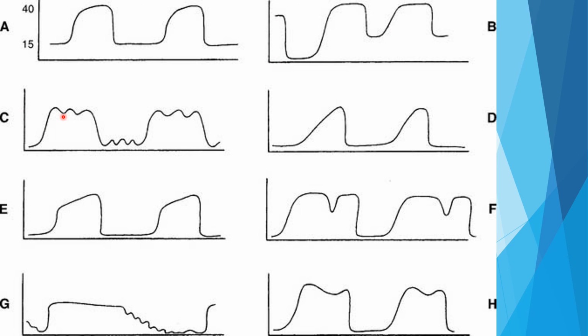Here is distortions from an incomplete exhalation. This may be caused by hiccups. They say chest compressions, but I don't completely agree with that, because if you're having perfusion going on, you'd have return of spontaneous perfusion, so you wouldn't really want to be doing compressions on somebody at that point. Here is that shark fin pattern. This would be somebody with COPD or long time constants, so it just trends all the time, then plateaus.